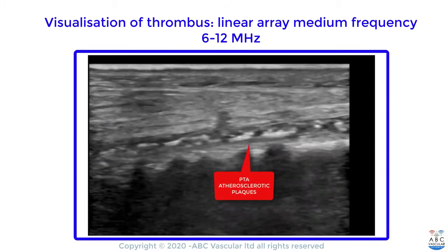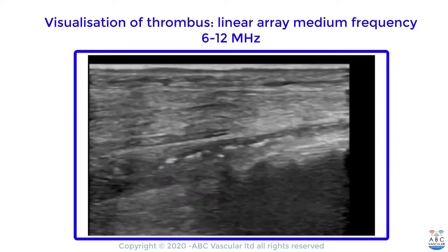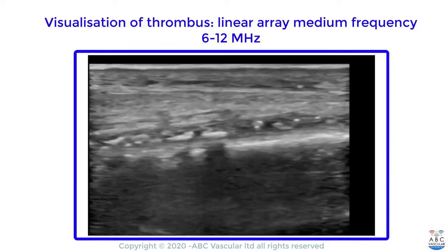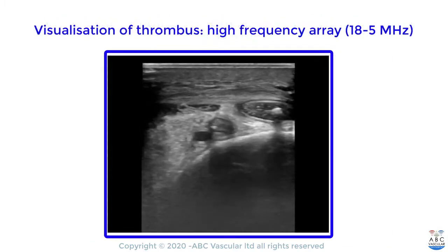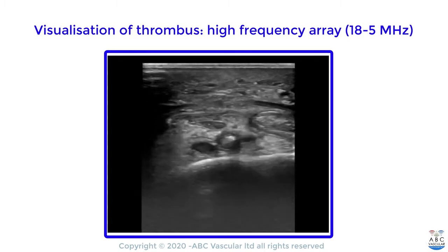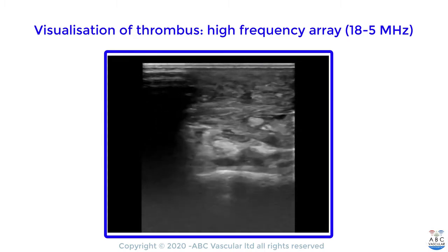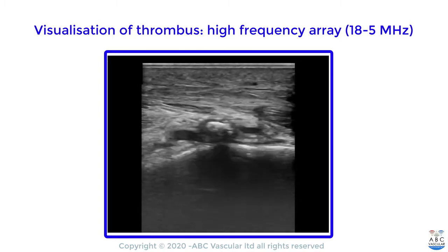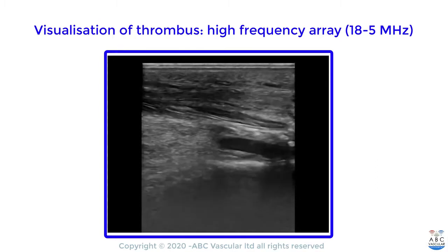In order to improve the visualization of atherosclerotic disease in the posterior tibial artery, we can use a linear array with higher frequency at the level of the distal posterior tibial artery. This will improve the lateral resolution and provide better visualization of the occlusive thrombus noted throughout the posterior tibial artery.